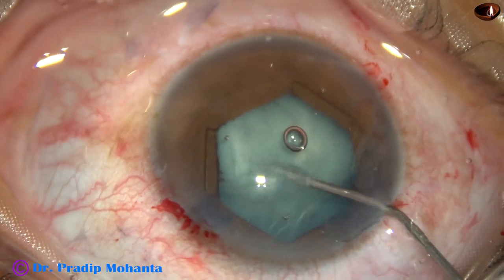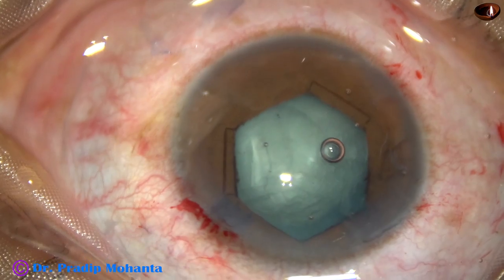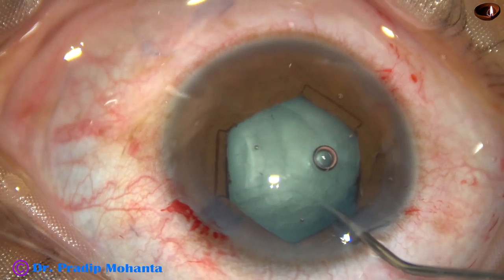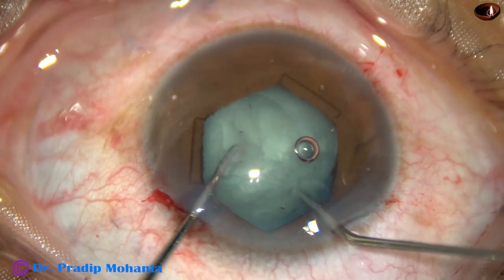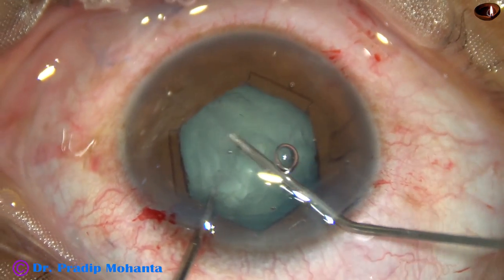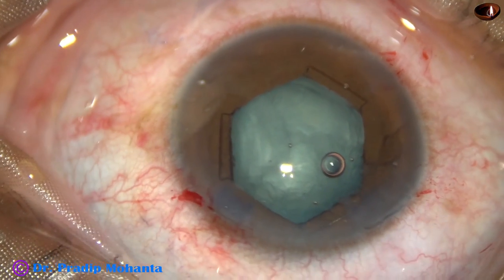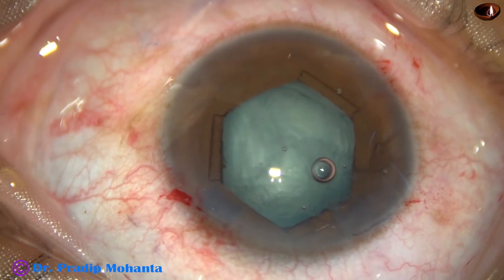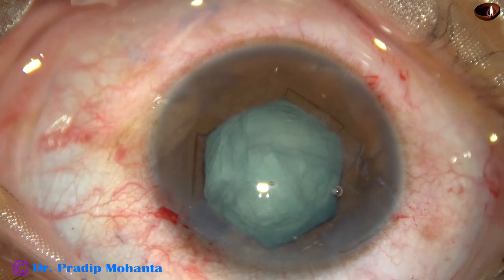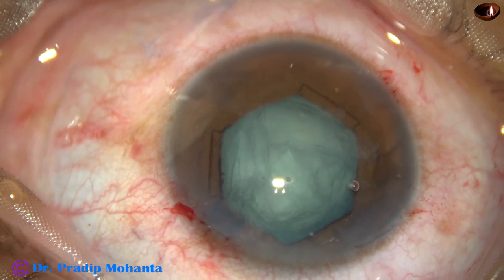Now I do some hydrodissection with a 27G cannula and BSS. I find that the cataract is white but very soft. So I am trying to apply my technique of dividing such soft cataracts with the hydro cannula itself and a chopper — whether it is successful or not, it will help in emulsifying the lens mass.